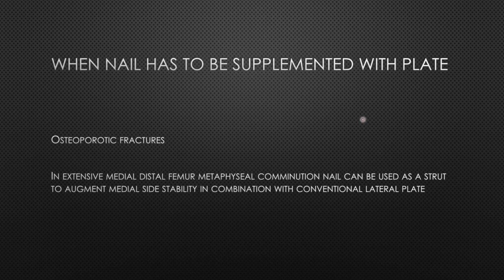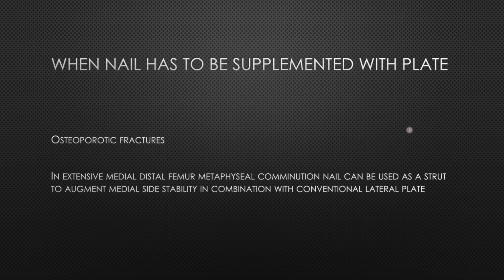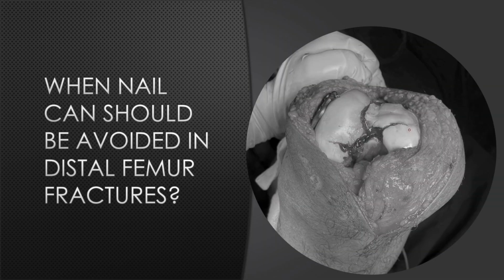In osteoporotic fractures and in those fractures which have extensive comminution in the metaphyseal part, the nail can be used as an intramedullary strut, but it has to be combined with a plate. That means you need more stability in those fractures. The nail alone cannot provide that kind of stability because the nail will provide only 4 screws maximum in this part. The screws that are going through the nail holes are 4 in number. There might be more recent designs. It's better to supplement the nail with a plate in those scenarios in which you suspect that the stability may get compromised. So we'll be covering those topics in later slides.